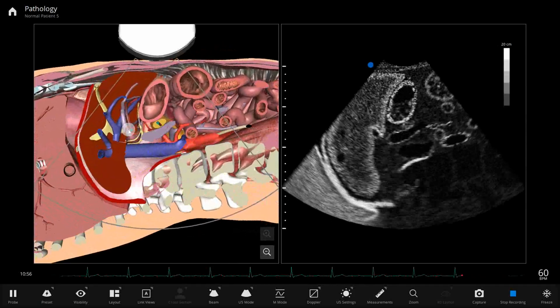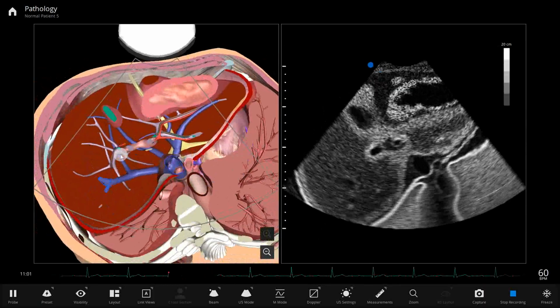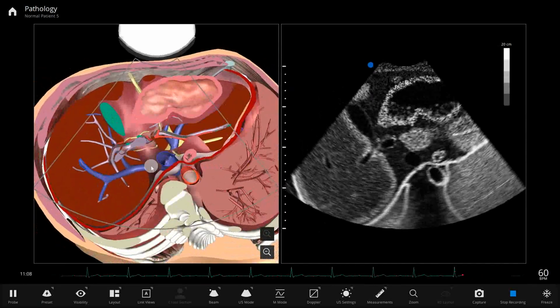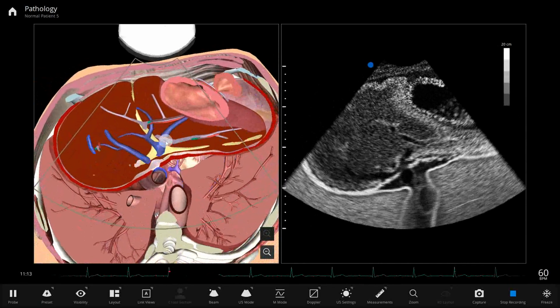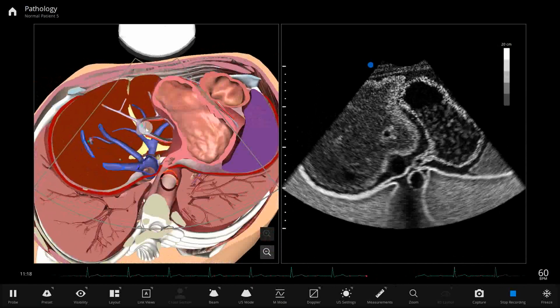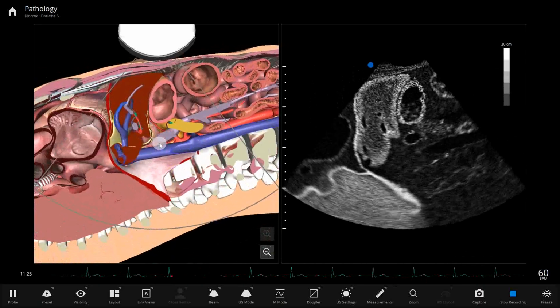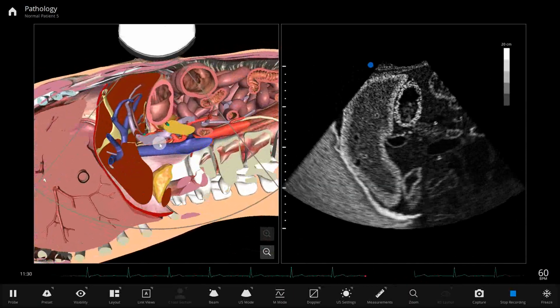orientation. Once they enter the liver, they're going to split, okay, into right and left portal vein. The right one's going to have a right posterior portal vein, a right anterior branch to the portal vein. The left side is going to do something similar. You can see we got this one here, and we got one right here. Portal venous system is going to run all the way through that liver, and it's going to form the portal triad with the hepatic artery and the common bile duct.